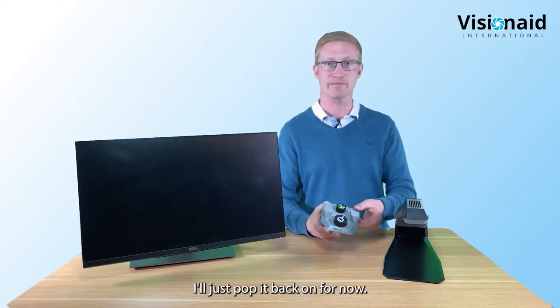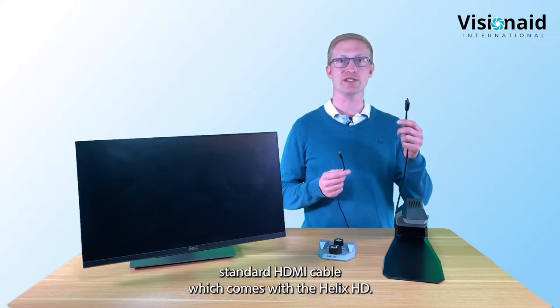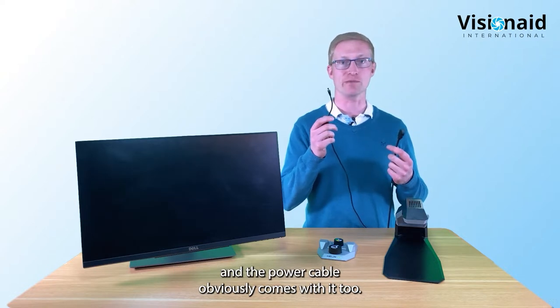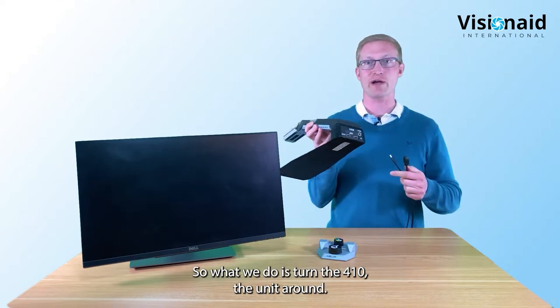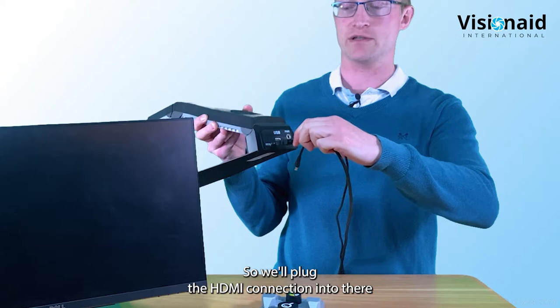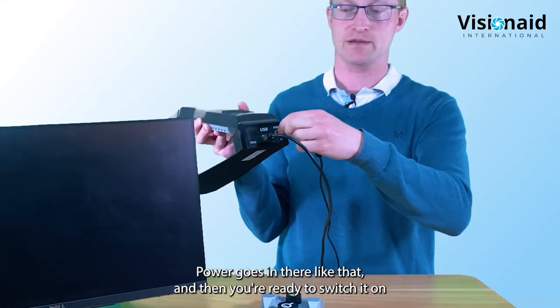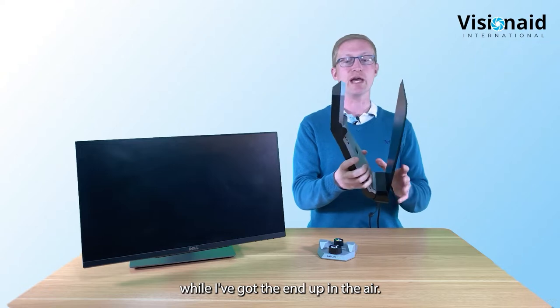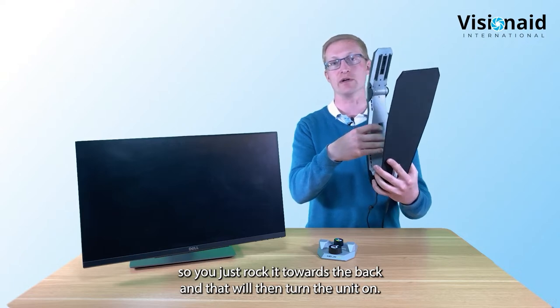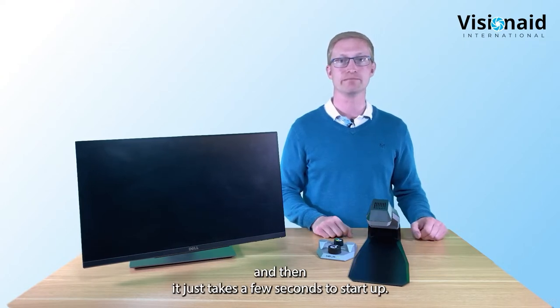Now we're going to connect it to the screen. I've got a standard HDMI cable which comes with the Helix HD - it's a good length to connect to a television screen. The power cable also comes with it. On the back, there's the monitor connection on the left-hand side for the HDMI, and on the far right there's a round DC jack for power. The on/off switch is under the unit - it's a rocker switch you rock towards the back to turn on.